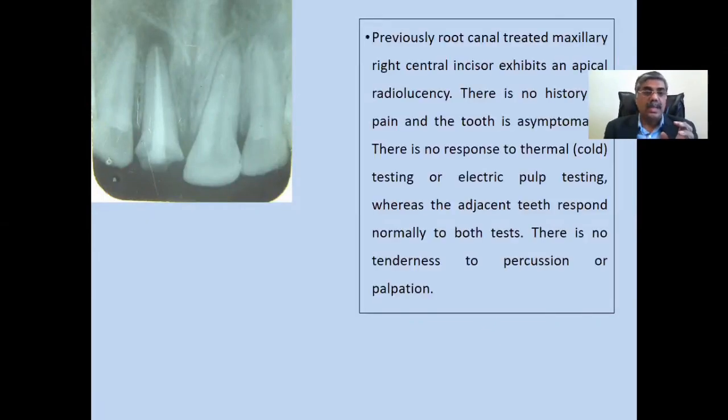take another situation. So here is a radiograph which we have already seen. There is a root canal treated central incisor, right central incisor. But the obturation was not good at the apical third. You can see there is no complete obturation. So it has resulted in a well-defined periapical radiolucency there, size less than 1 centimeter. Loss of lamina dura is there.